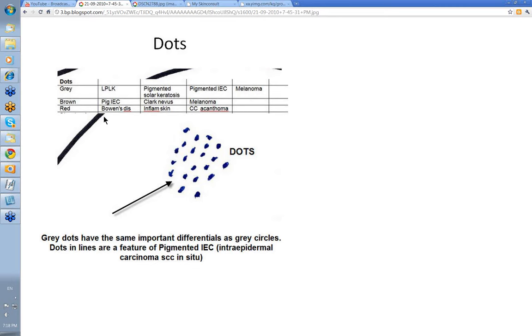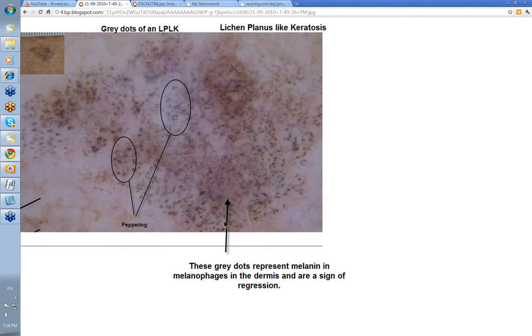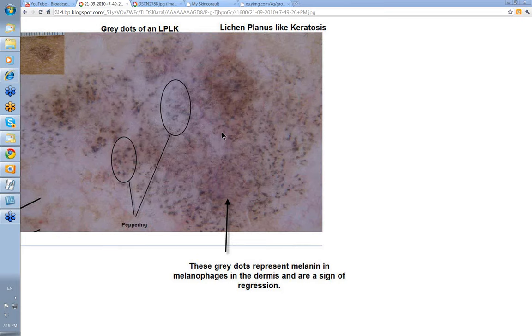Remember the grey dots and those four little diagnoses. Starting with grey dots — you can't see the clinical terribly well, but this is basically a pigmented lesion. When you put your dermatoscope on it you see these coarse grey dots scattered throughout the lesion, with some brownish structure in the background. This is sometimes described as peppering. These grey dots represent melanin and melanophages in the dermis and are a sign of regression. This is a lichen planus like keratosis — an LPLK — and we don't know what the underlying lesion was, as it has very much regressed.